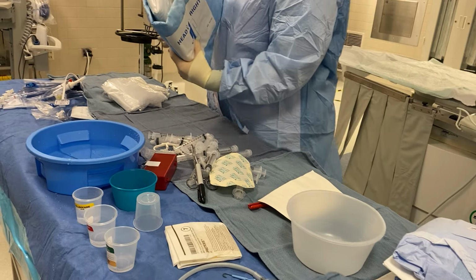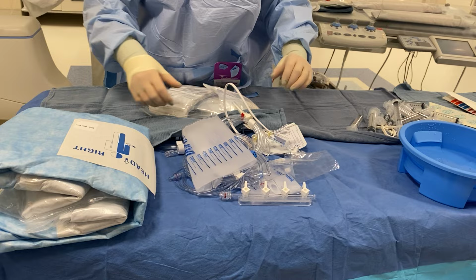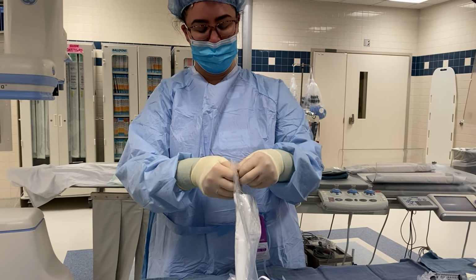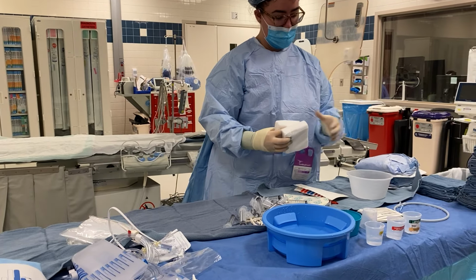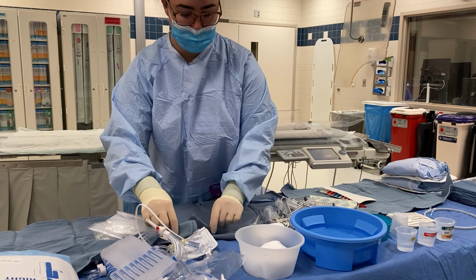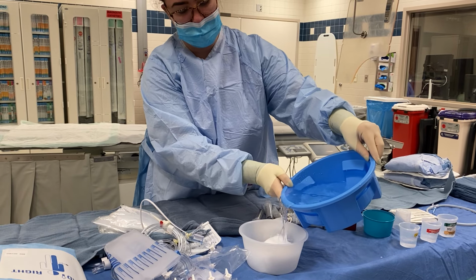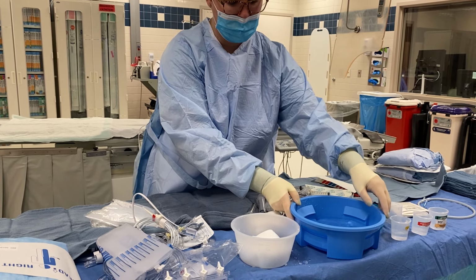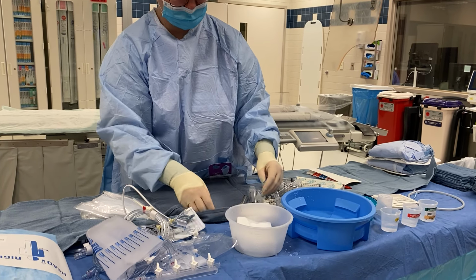I'm going to go ahead and set my drape up in the far corner because we won't need that until it's time to drape the patient. And then we have our package of 4x4s here. I'm going to pull those out of the bag, and I'm going to stick about half in this bowl and the other half we're going to keep out, so we can keep these nice and dry. And then with this saline, I'm just going to dump some right into this bowl. This way we have access to some wet 4x4s that we can use throughout the procedure to keep all of our equipment clean. So it's nice and saturated.